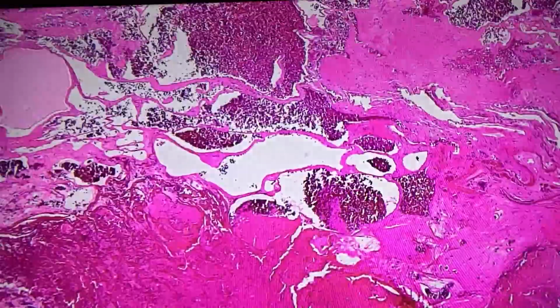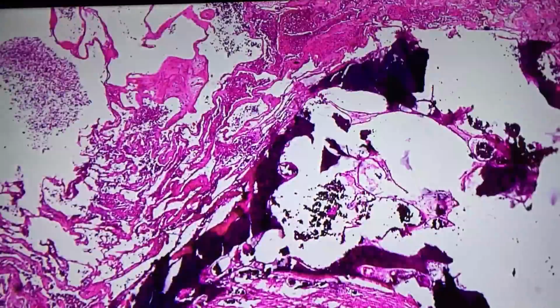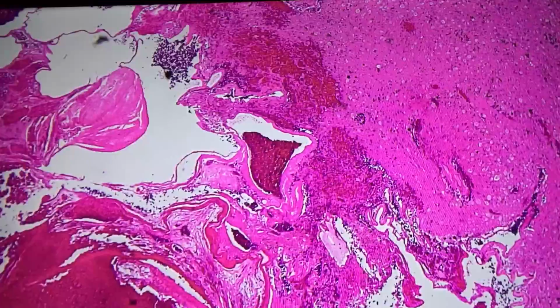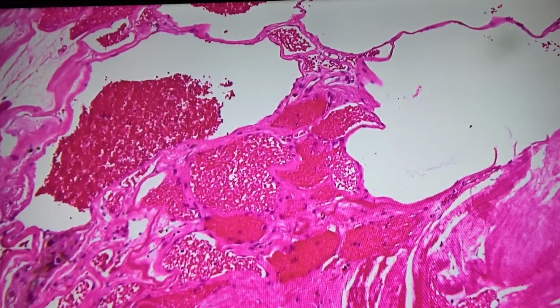Let's see. If I get it wrong, just correct me. All right, what is this lesion? Maybe... That would actually be a good thought. I thought the same thing, and it might actually be correct. And you're actually seeing some hemorrhage in the surrounding brain, right? Yeah. This thing was actually called cavernous angioma. And you can see why, right?